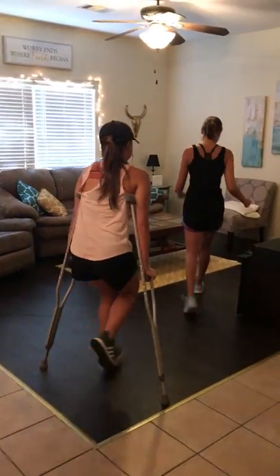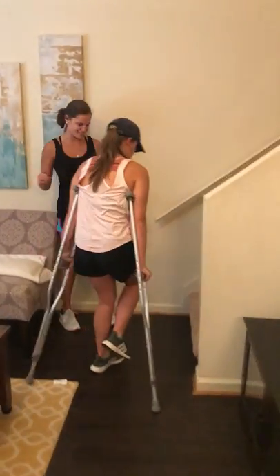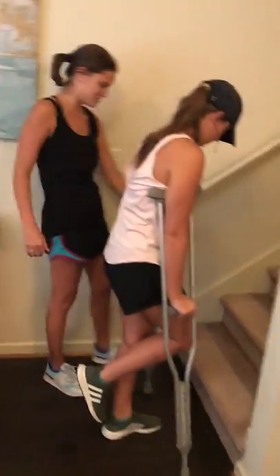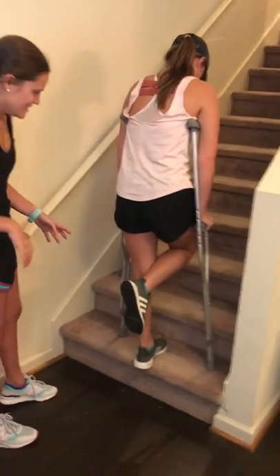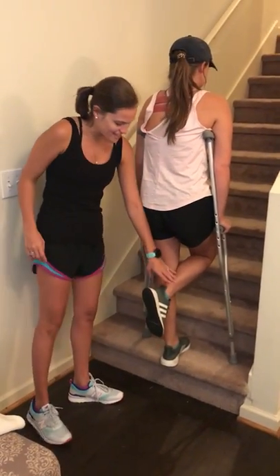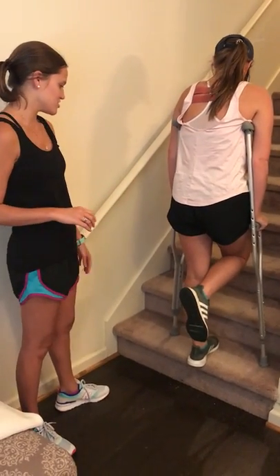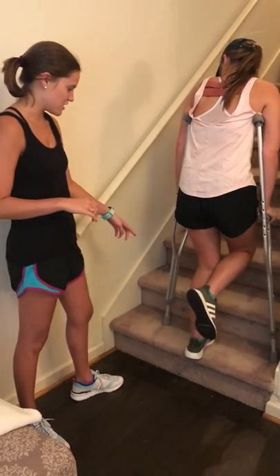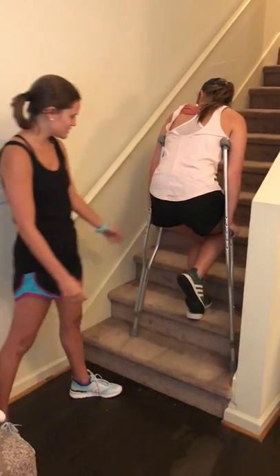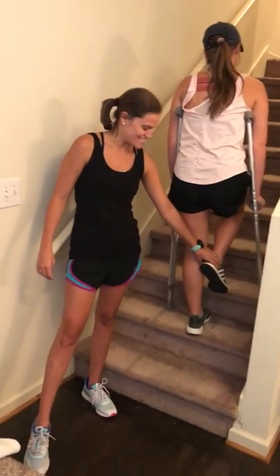Now we're going to walk over here and show how to go up the stairs and down the stairs. With a non-weight bearing right ankle injury, to go up the stairs you're first going to start with your unaffected leg — go up the stairs with that leg, then follow it with your crutch and your affected injury leg.